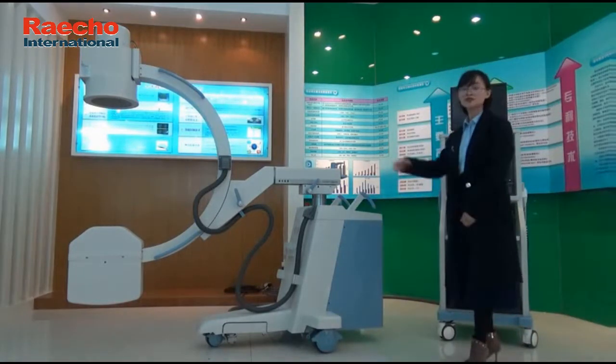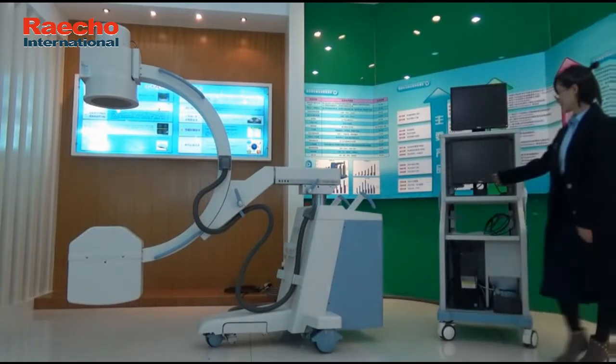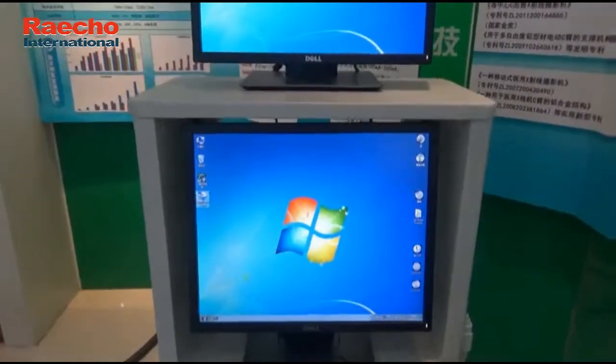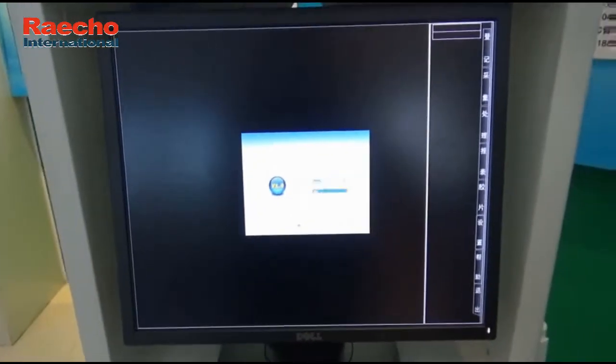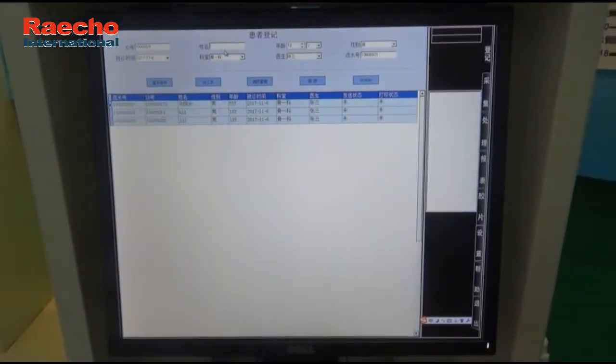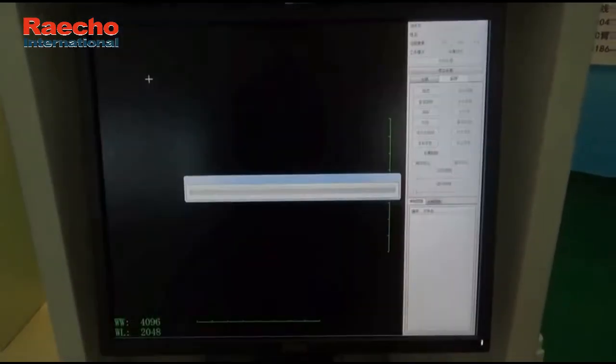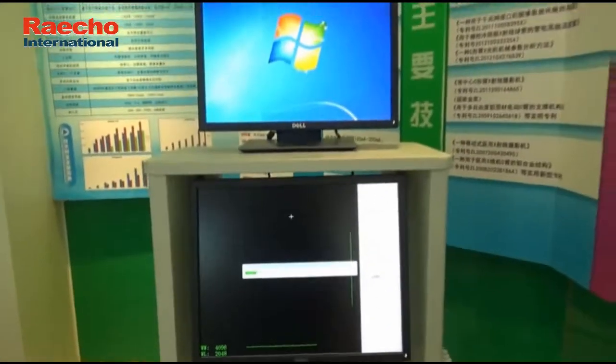The first thing you do when you come into a room before you use the system is to include the patient's information. Double-click the icon on the desktop to enter the workstation. Select the username APC and log in directly. This is the worker interface. First, register the patient's information, such as the ID number, the name, the age, and then click Save. The system then enters the acquisition interface automatically.